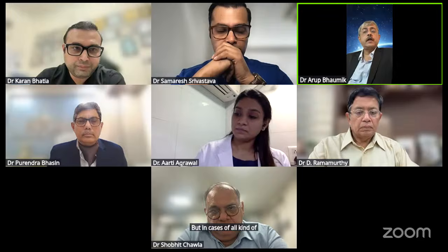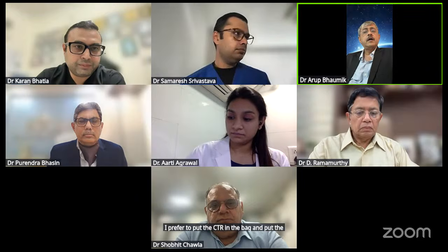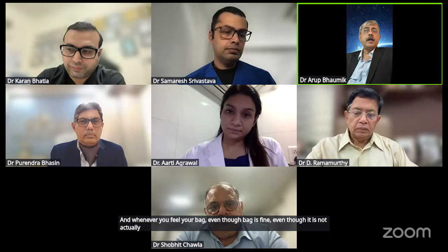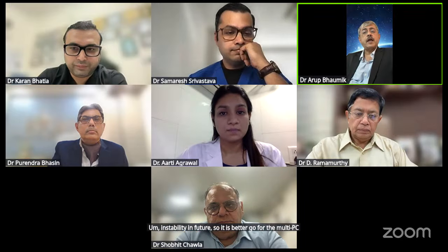But in all cases of pseudoexfoliation, whether it is a subluxation or otherwise, I prefer to put the CTR in the bag, put the multi-piece lens in the sulcus and capture the optics. This is the standard dictum. And whenever you feel that the bag, even though it looks fine, may get some kind of instability in future, it is better to go for the multi-piece in the sulcus and capture the optics.